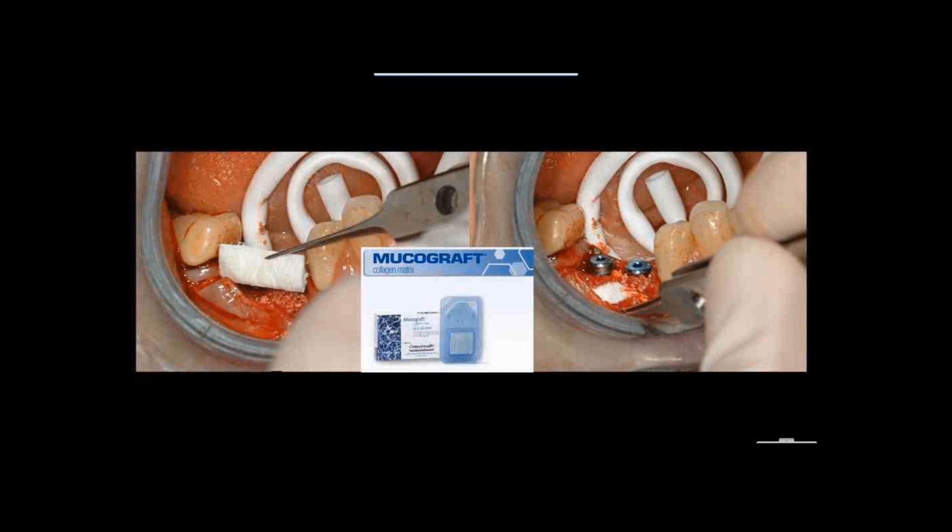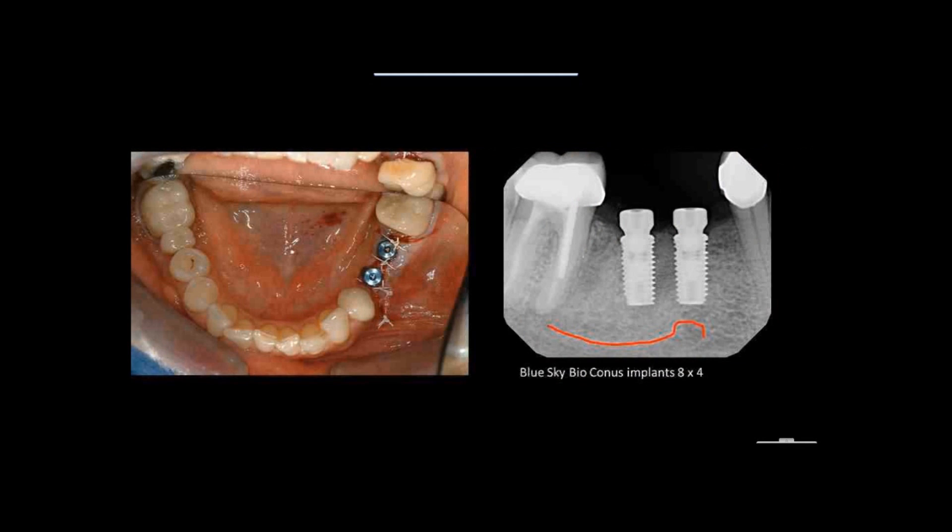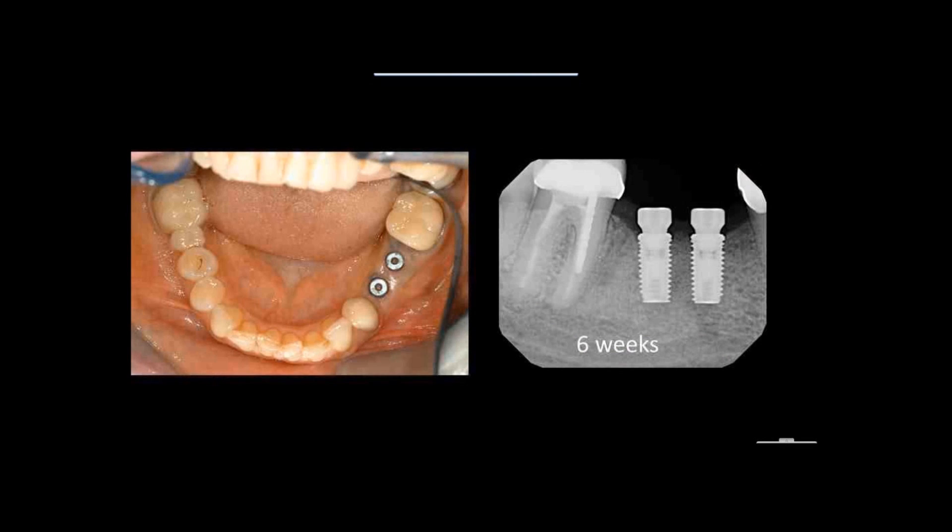This case had no attached tissue at all when we started. We increased it somewhat during our first procedure, and as we moved along we got more. We bring the mucograft in there and close up the site. Here we see the two implants placed. Six weeks later, you can see no bone loss at all on our conus implants, and we have nicely enhanced the attached tissue on the buccal of this site.